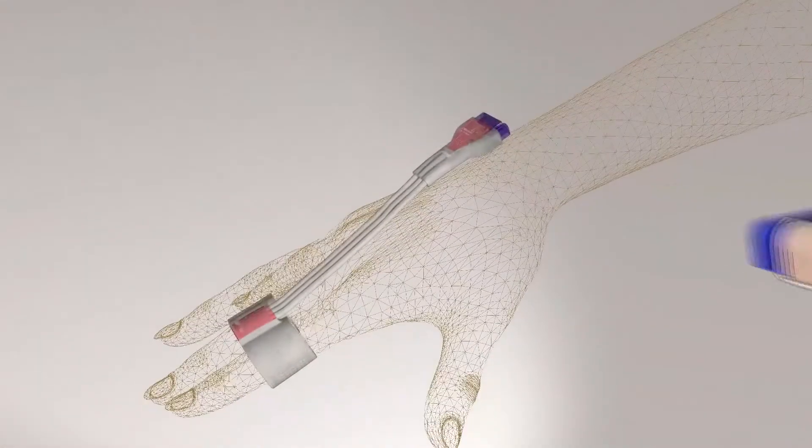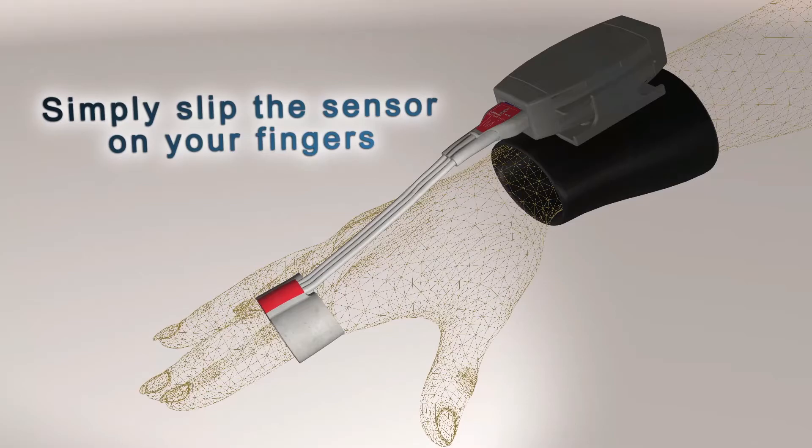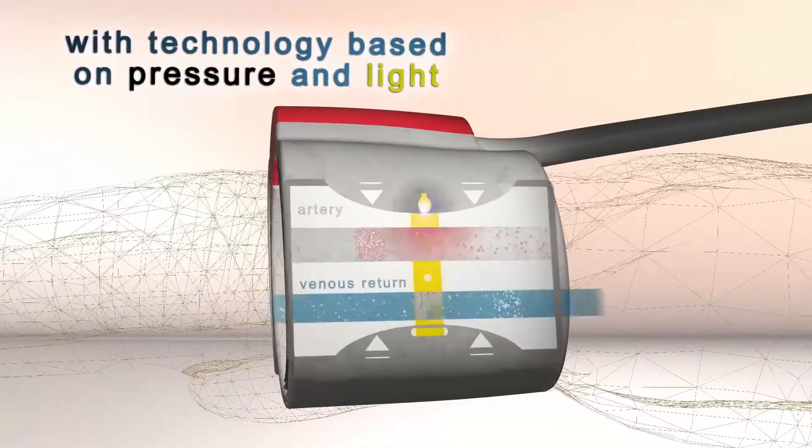To start a recording, simply place the double finger sensor on two neighboring fingers and connect it with the controller unit on the subject's forearm. The CNAP technology is based on pressure and infrared light.